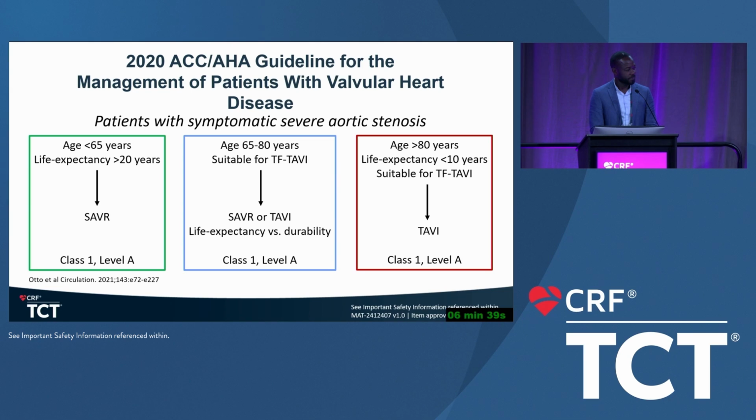Definitely a recapturable valve, just like in this case, where we recaptured and put it in a better position. And some of the terminology I'm not a fan of. When we talk about Sapien valves and 80-20 implants, none of us are going to agree what an 80-20 implant is. That doesn't make any sense to even talk about it that way. So we're cautious in how we tell the patient what their future options may be.